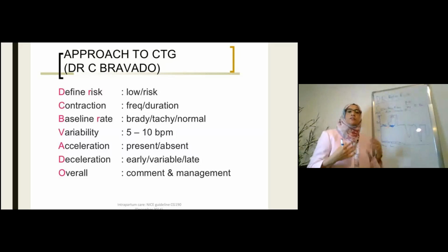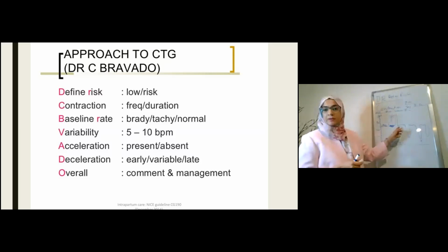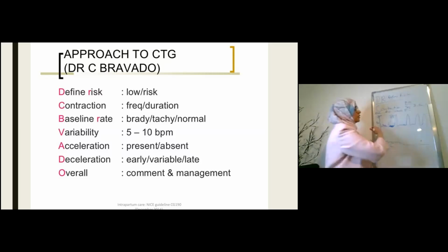And then it just thinks about, oh my God, I'm going to come out and see my mama. It's happy, it does a nice acceleration, then comes back to baseline. It moves about its legs, hands, arms, happy baby, right? So you will see happiness by continuously seeing the baby with a little bit of accelerations like that. So that just makes a happy CTG.